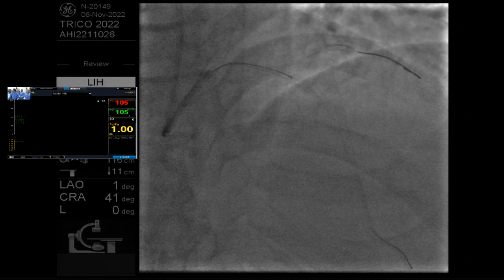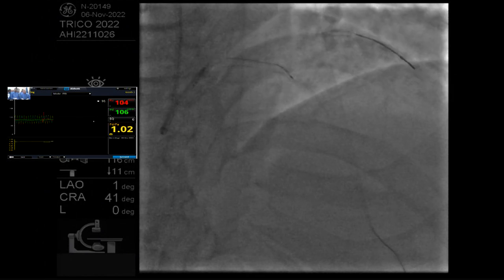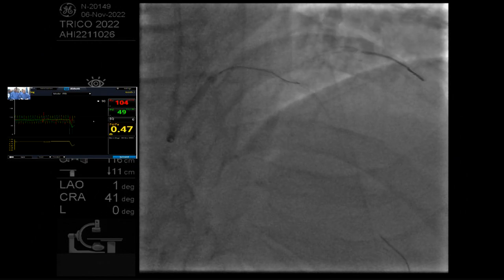Can I ask one simple question? I apologize for the simplicity, but when you're doing FFR with an ostial stenosis, is it okay to bring your guide out at the end, so normalize like it is now, or should you always normalize in the aorta before starting?